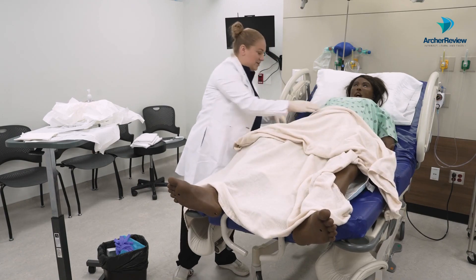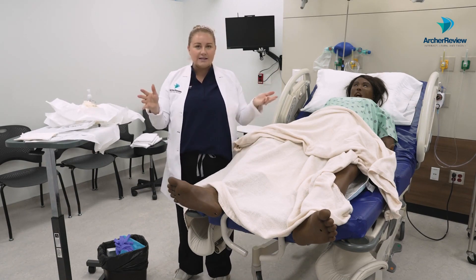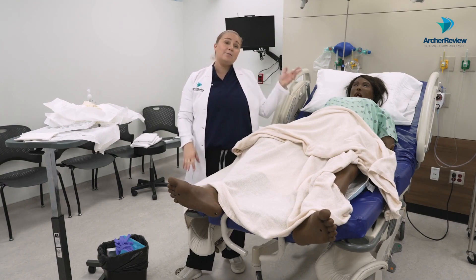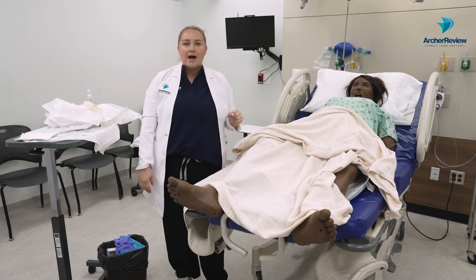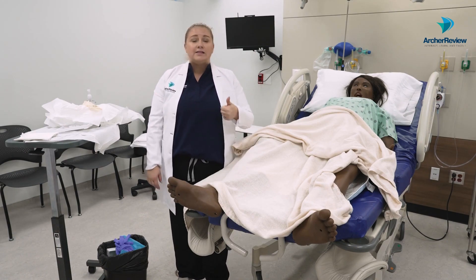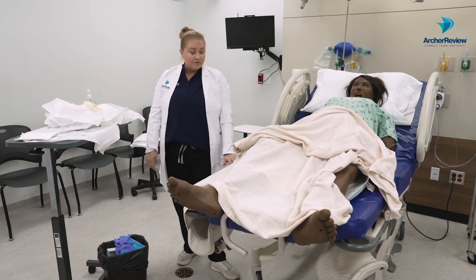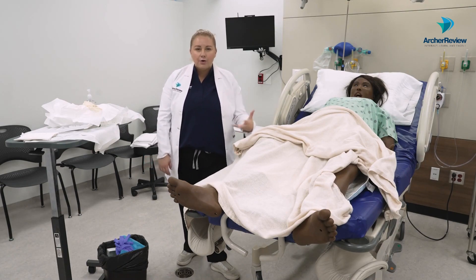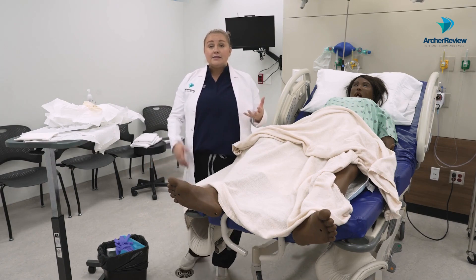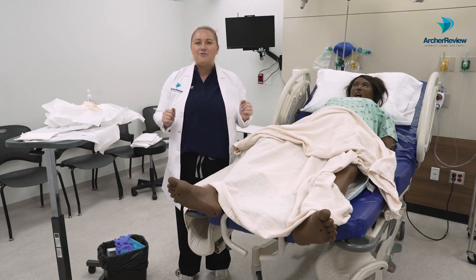Let's cover her up, take off those dirty gloves, and perform hand hygiene after we dispose of all supplies. When we leave the room, we lower the bed, raise the side rails, and place the call light within reach. Then we document the entire procedure. Things to note in documentation: how many mls or cc's of saline you put in the balloon, where the catheter was secured, and if you got urine — the color, odor, consistency, and amount. We want to monitor that in the drainage bag and note it in our ins and outs accordingly.